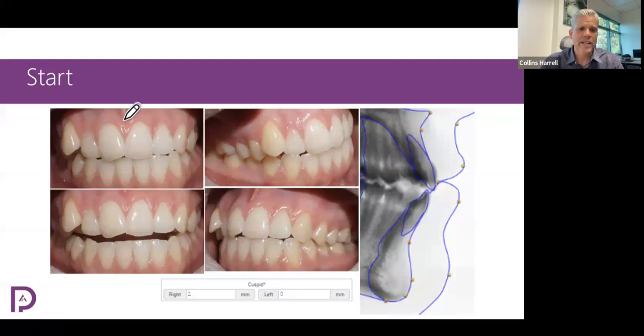Her midlines don't line up. Okay, so here's the upper dental midline, and here's the lower dental midline. And it should be a red flag. We're going to want to identify where that is coming from. And it may even be a reason, if you don't understand the case, to have a consultant or mentor, and it may be a case that you end up not treating. Okay, but in this case, it was diagnosed and treatment planned very well and treated very well.